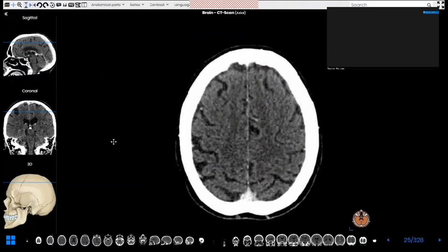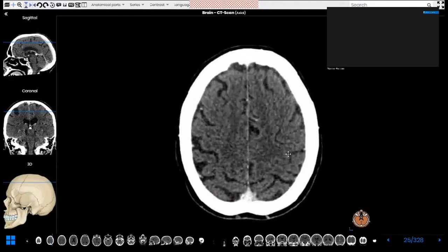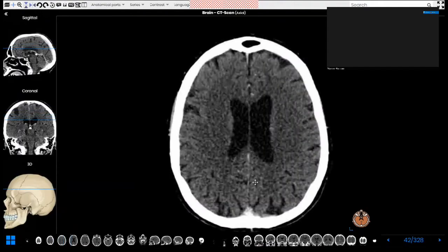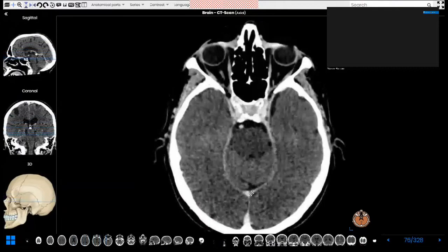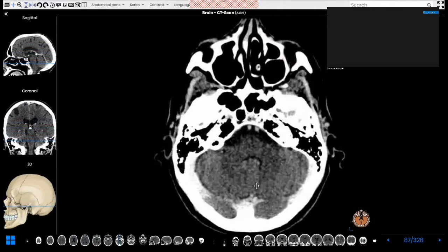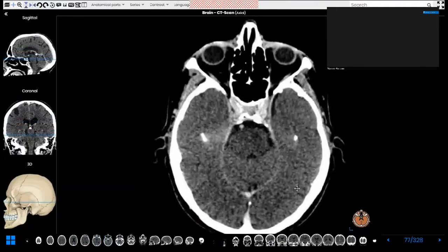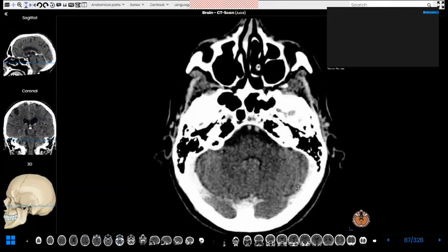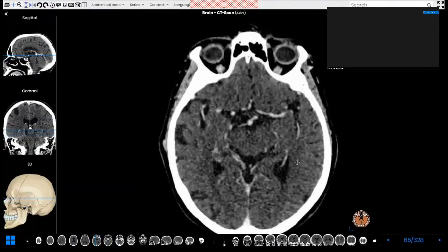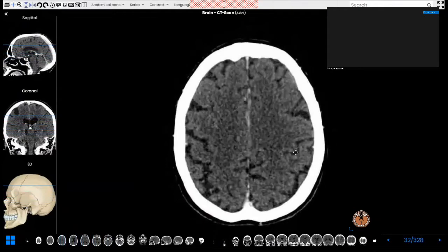On these images, this is the right cerebral hemisphere, this is the left side of the patient, this is the anterior aspect, and this is the posterior aspect. In the midline, there is a falx that separates the two cerebral hemispheres. As we scroll down, the falx cerebri is continuous with what is called the tentorium, which looks like a tent. Everything above the tentorium is supratentorial, and everything below is infratentorial.